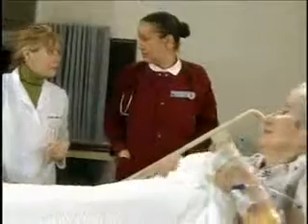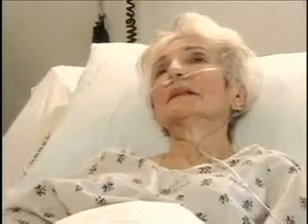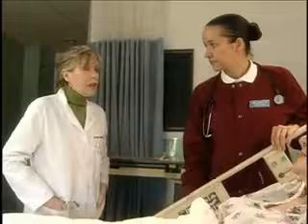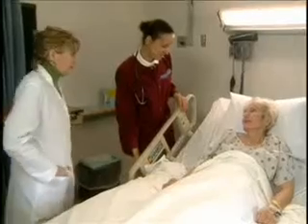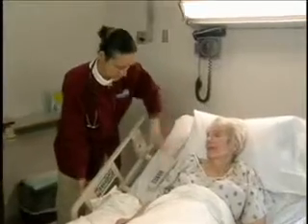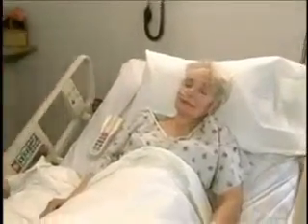Okay. Last thing, as always, document the procedure. Note the nature and amount of the secretions, your respiratory assessment before and after the procedure, and your patient's response to the procedure. Okay. You doing all right now? Good. This here for you. All right. See you in a little bit. Bye-bye.